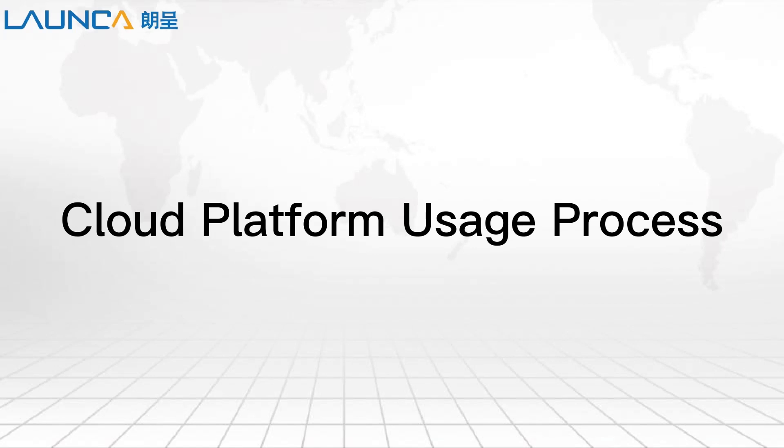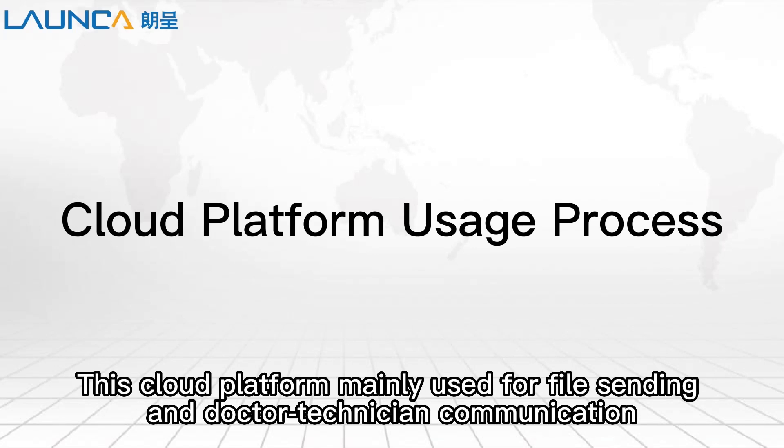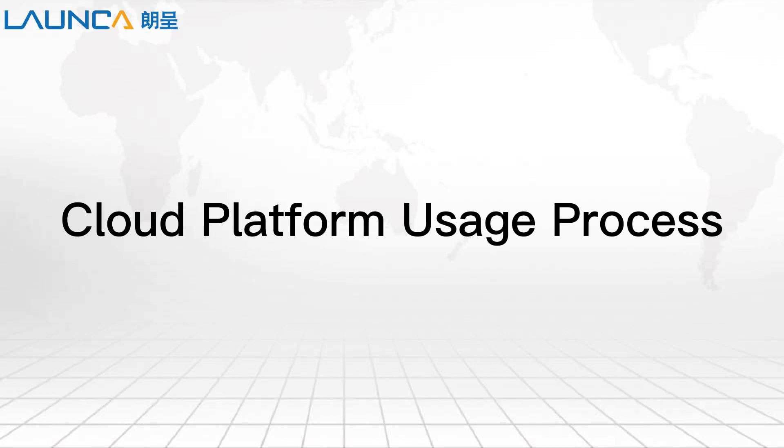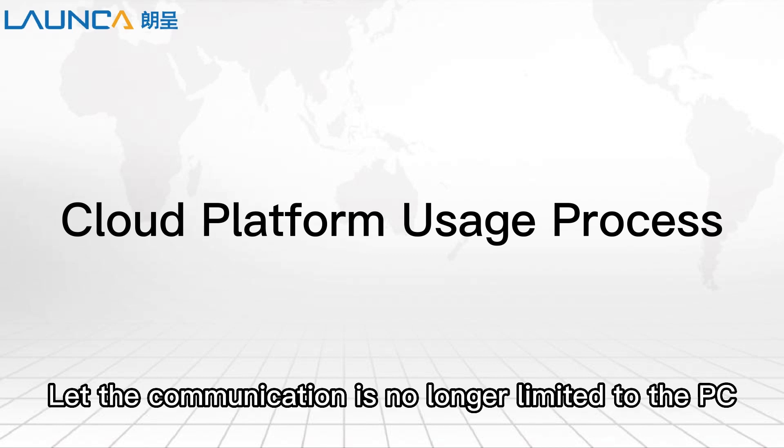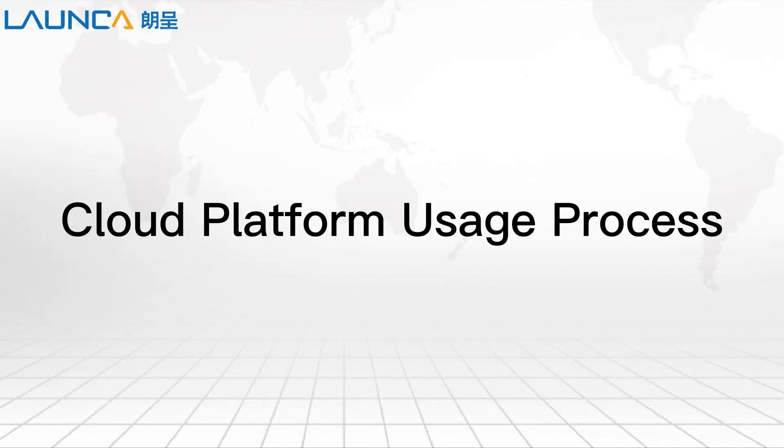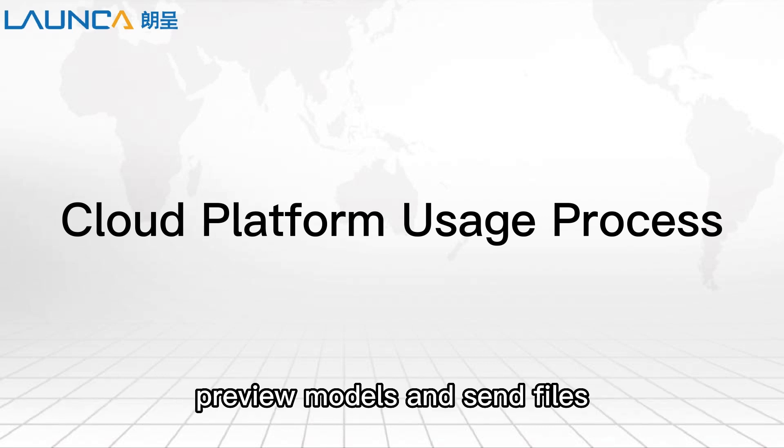This video will introduce the process of using the cloud platform. This cloud platform is mainly used for file sending and doctor-technician communication. It works the same way on mobile phone and computer. Let the communication is no longer limited to the PC, but also can be done on the mobile phone anytime and anywhere to achieve remote communication, preview models, and send files.